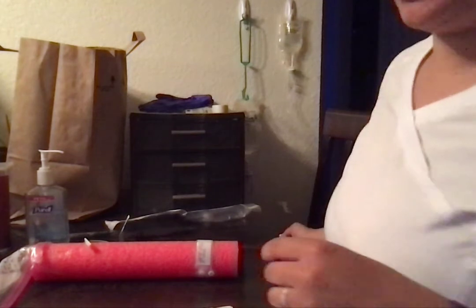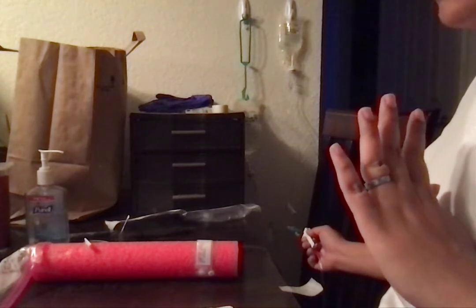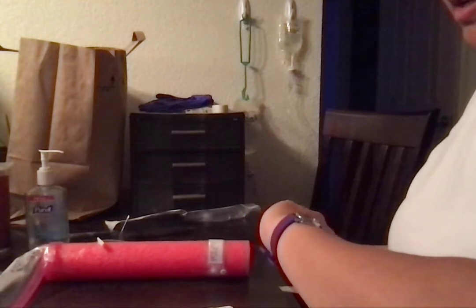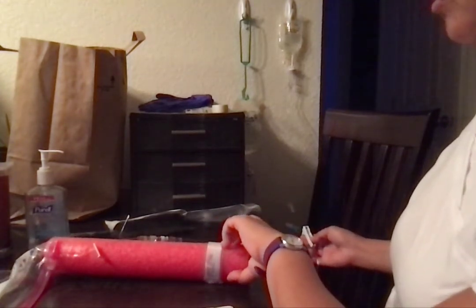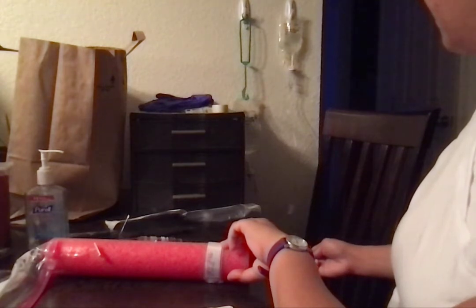And we have the drip rate of 25 drops per minute. Let me just make sure I have everything that I need here. Okay, so now I'm going to count for a full minute, getting 25 drops. So that's about 2 drops per 5 seconds. So let's get that going, nice and slow.